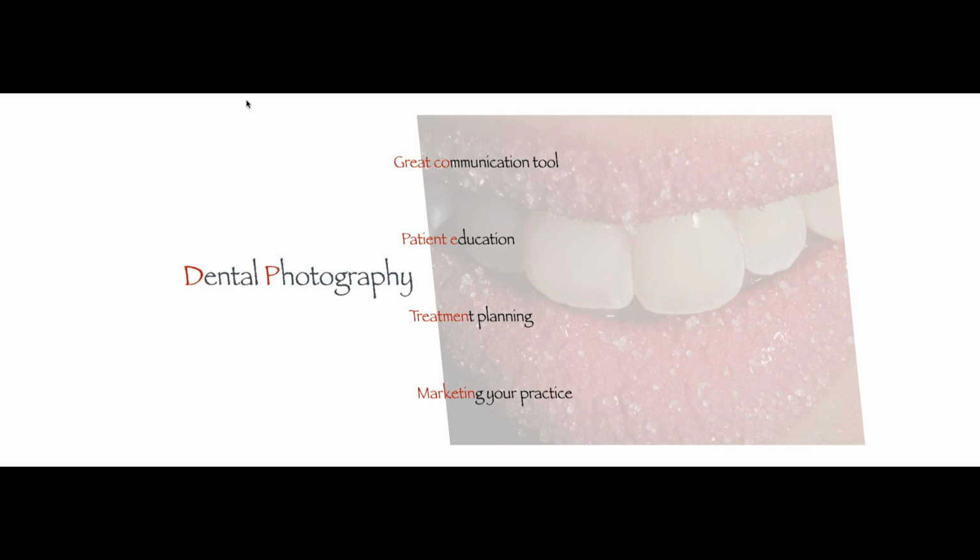But when I was saying patient education, through this sequence of photographs, patients are going to really understand every single step you decided to take from point A to point B, so that you can achieve a really good result. And that for me is key, because these photos will answer the questions your patients really want to know, in a very graphical way.